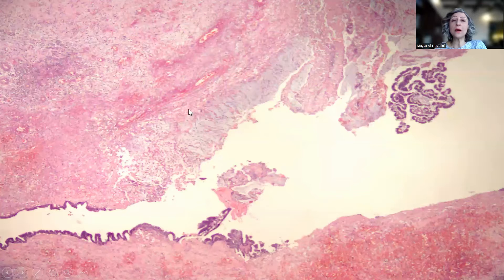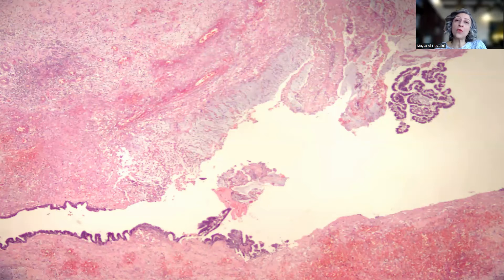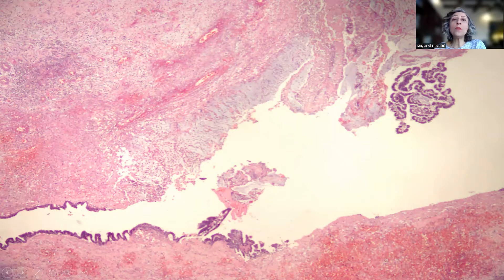We're going to zoom in now with areas of mucin here and then the lining of the lesion. It's very important, as I alluded to before with the HAMN — the high-grade appendiceal mucinous neoplasm — to remember that with these neoplasms, the normal architecture of the appendix is completely lost.